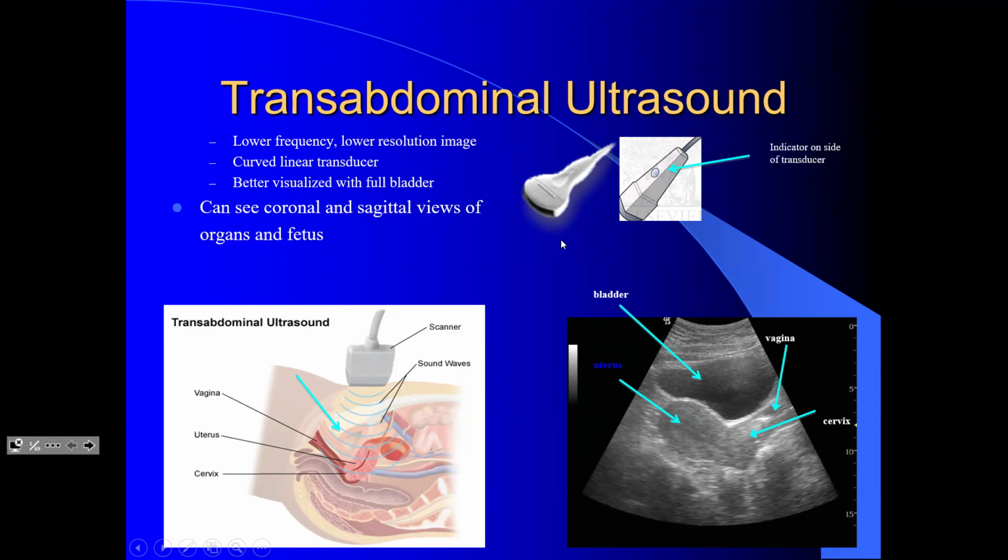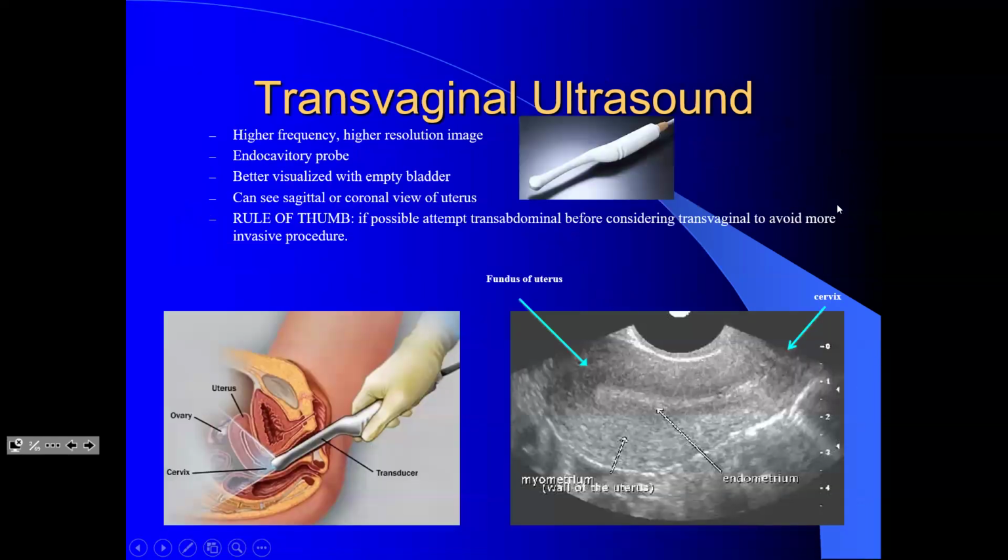The good thing about abdominal ultrasound is that it gives you a broad picture. You will be able to see all structures. Like if you just go up, you will be able to see the abdominal structures. Likewise, you can go into the adnexa, look for the ovaries. But when you're doing the internal scan, you have a very limited field in front of you. So you're just able to see the uterus or the adnexa where you have the ovary. And if you want to go up, obviously you cannot, because the high frequency probe doesn't allow you to see structures beyond a limit. So this is the transvaginal probe, which has a long handle to it, but it has a better maneuverability to it.